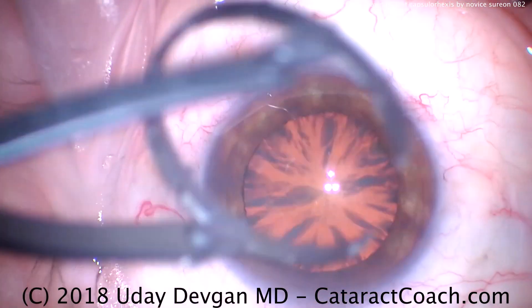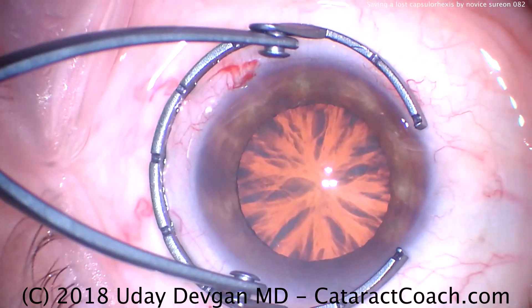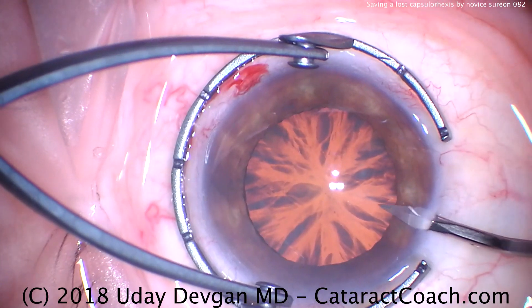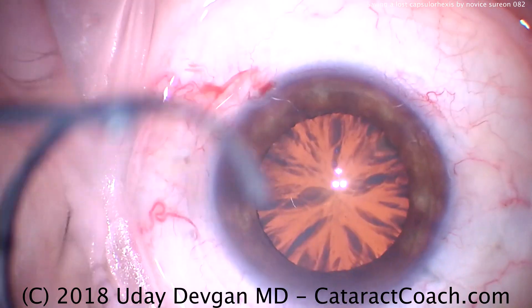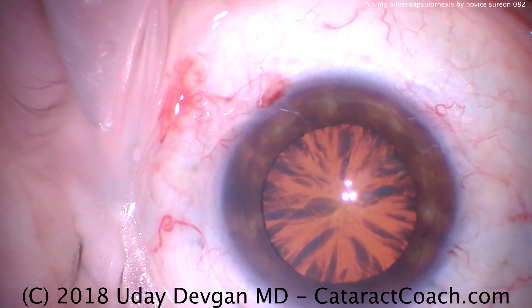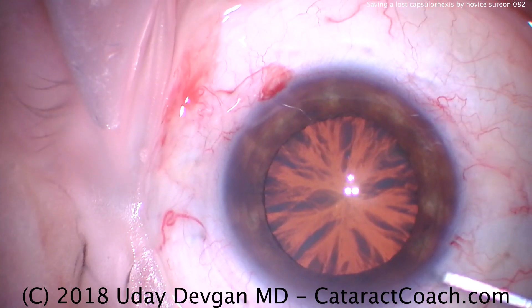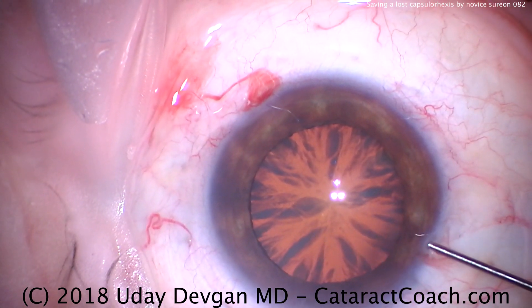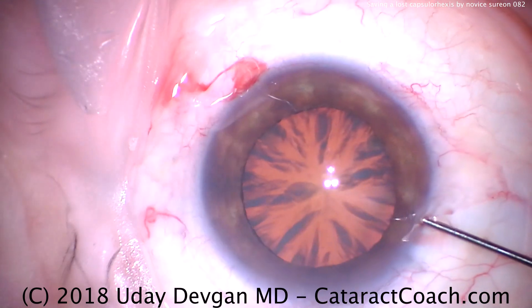Here's the resident making the main incision. I'm going to put a fixation ring down and hold the eye gently. There's the paracentesis. Now you can tell the paracentesis for the resident is with the right hand — therefore, this is a left-handed resident.